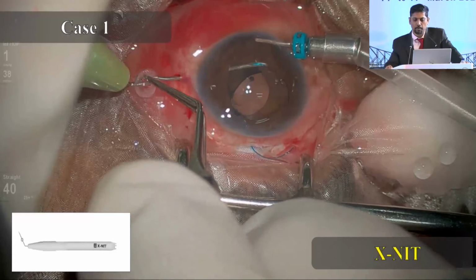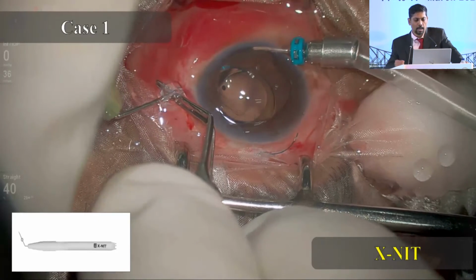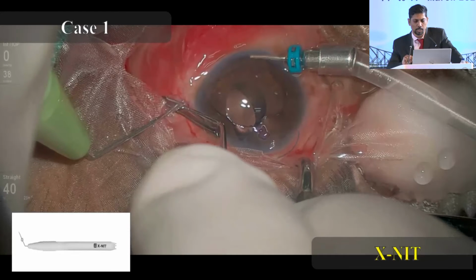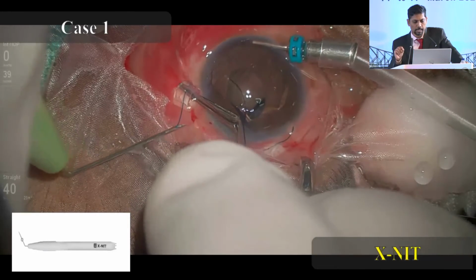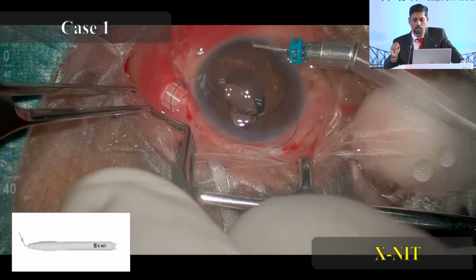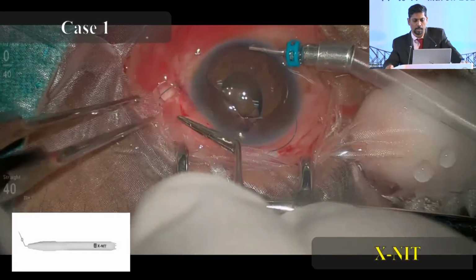And remember, we have done docking outside the eye, and we are not going to do anything inside the eye. Simply slide the dual protection silicone stopper close to the sclera and try to retrieve the haptic. Wait for the blue portion to be seen, hold it and disengage the needle. That's it. Single movement. Now the silicone stopper is on the haptic. You don't have to be dependent on the assisting nurse who may not follow you closely always.